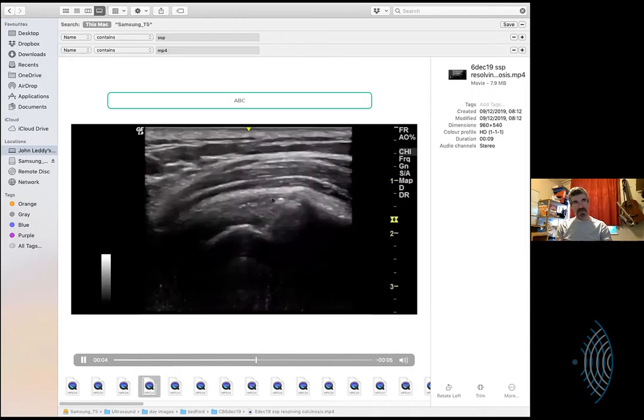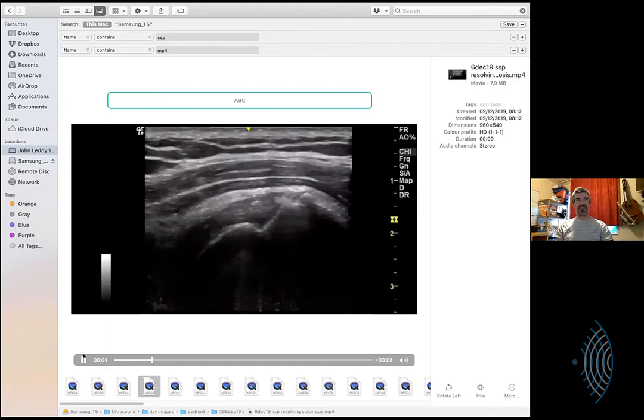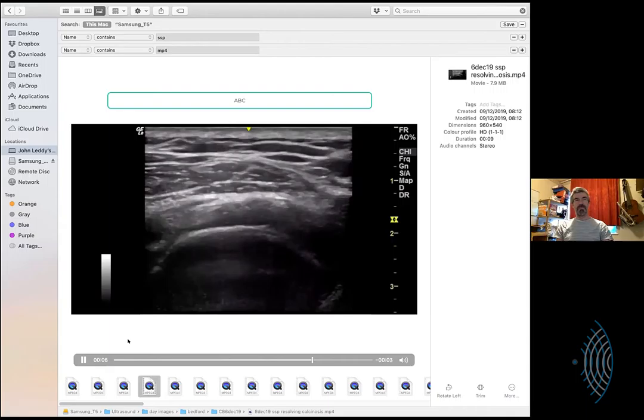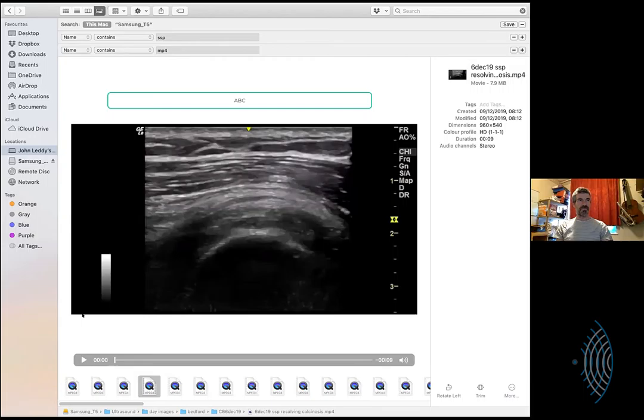This I think I called resolving calcinosis. This was one where I'd seen the patient previously, and they had calcific tendinosis, and then we saw them again, and they had just this appearance here, just a little bit of calcium. I wouldn't be sure that was calcinosis primarily if I hadn't seen the patient before. But that's what happens, it just gets better. So it still looks a bit untidy here. Yeah. And there's some tendinosis within the tendon, I think. And some periosteal issues too.